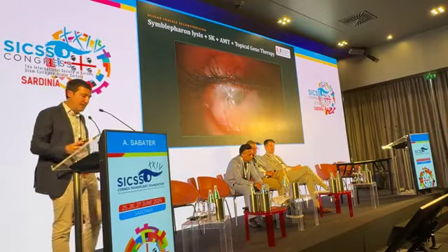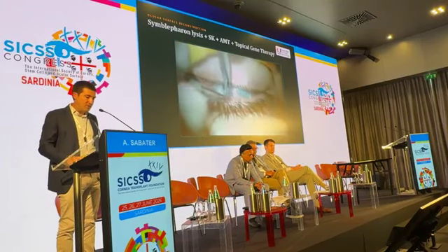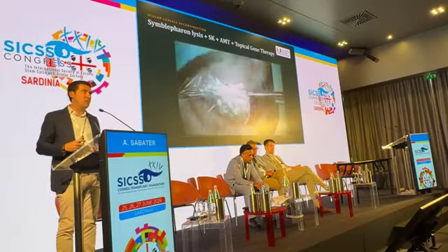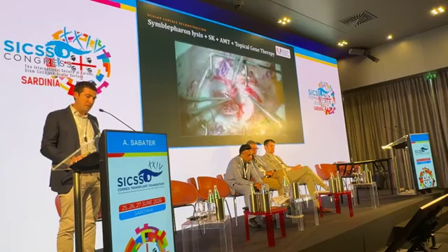So here's a quick video that just shows the surgery. We decided to treat the other eye, the eye that had not had surgery before. First, we just remove all the symblepharon. With these kids, the surgery is complex because even the intubation is very complicated. Even when you put your hands on top of his forehead to do the surgery, you have to be careful, because in previous surgeries he developed ulcers on the forehead just from the contact. That's why we put those special drapes to protect the eyelids from the speculum.